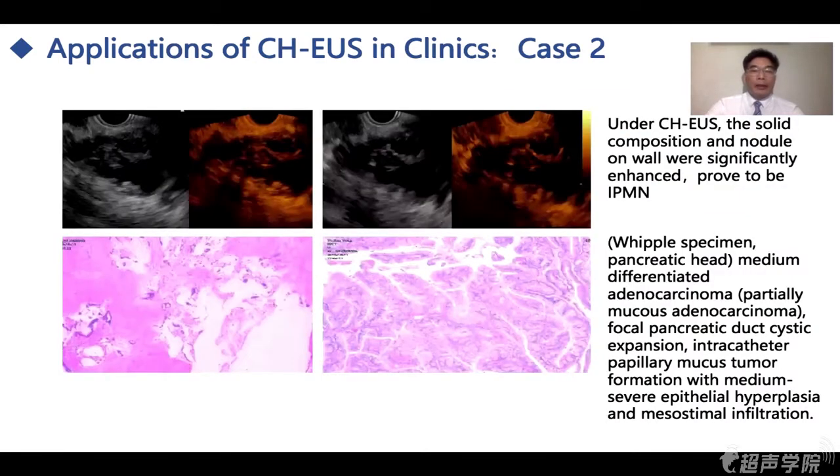IPMN is considered. With CHEUS, the solid composition of the nodule on the wall was significantly enhanced. Proven to be IPMN. This is the operation specimen.